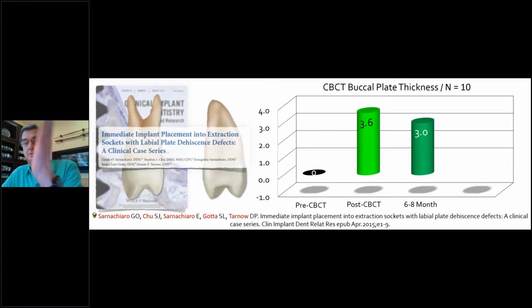Then at 6 months, we took another CAT scan and we realized we only lost about 0.6 of a millimeter, about half a millimeter. So we had 3 millimeters of what appeared to be buccal plate, really graft combined with new bone. And when we sound it, it feels like bone. This is 6 months later. And so we gained 3 millimeters of new buccal bone. That's particularly in bicuspids, that's pretty easy.